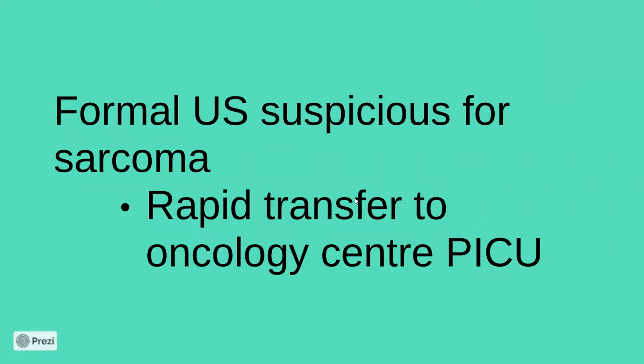Another brilliant case, Dom. Yeah, I totally agree. Like on the chest X-ray, I would have also said it looks like an effusion. Yeah. So yeah, great.